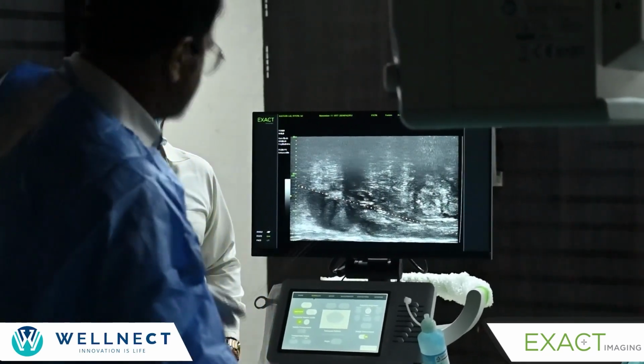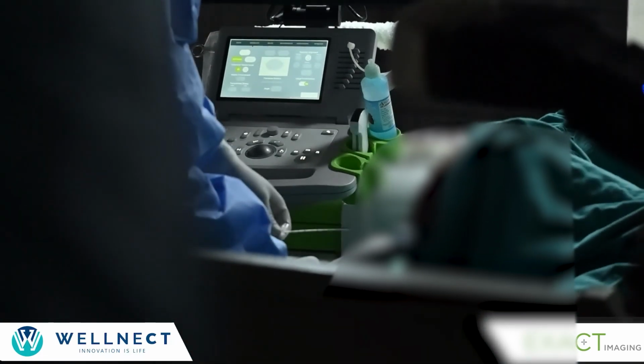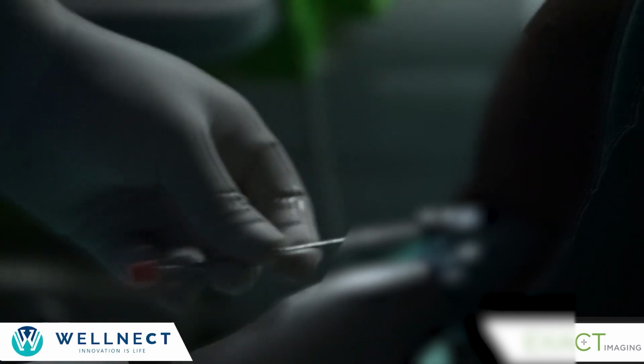So this is a 16 gauge needle, and that is how you see it from the attachment I am going over there, and then you can see the track. Okay, now you can see the track. Okay, it is rightly lining up along its track.